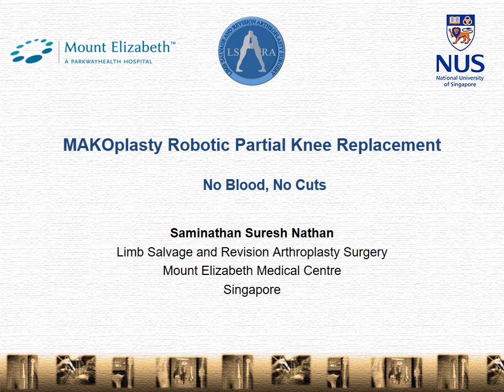Hello, today I thought I'd produce a video on the Makoplasty robotic partial knee replacement procedure with a real robot, with a slight twist. I've had some great feedback about our previous videos where we show the Makoplasty procedure in an actual patient, but there's a distinct viewership out there that's squeamish. So I thought I'd produce a video that would show the exact same procedure, but using practice bones, or what we call saw bones.